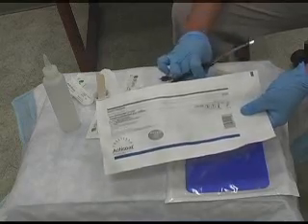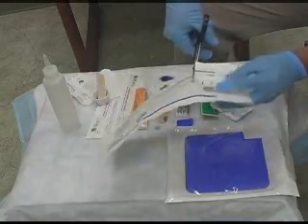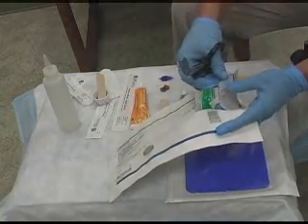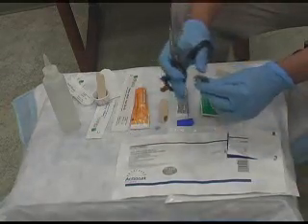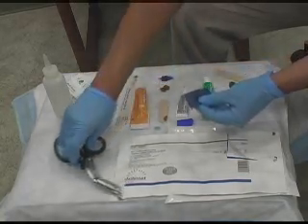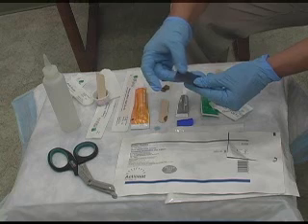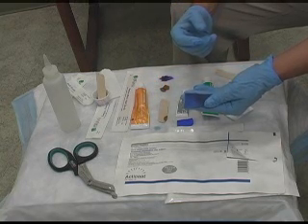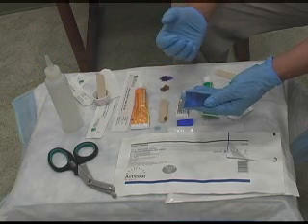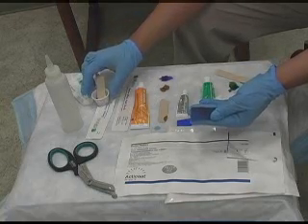This is another product that we use here called Acticoat. Acticoat is an antimicrobial, bacteriostatic dressing. Acticoat is a silver-based dressing — silver was used a lot for infection back in the day, and it's coming back. If you'll notice, the Acticoat is several layers and it does have a gray side and a blue side. There are a lot of questions as to which side you put down to the wound, but it does not matter. If the wound is not draining a lot, you do need to activate it. We use sterile water to activate it, because normal saline will actually make the silver ions bind to themselves.